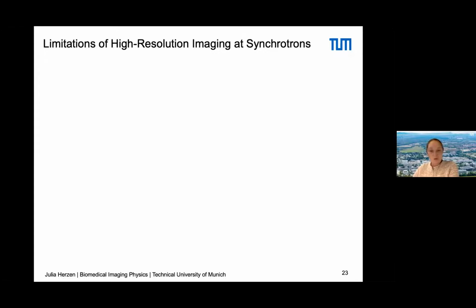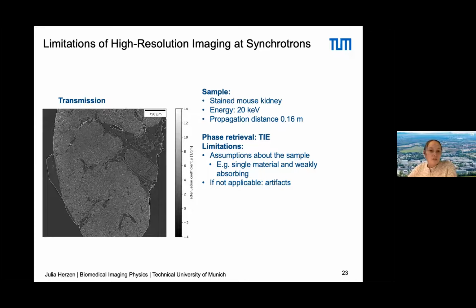The method that I presented to you, these gratings, was developed at the synchrotron. But if we go back to the synchrotron and try to perform high resolution imaging, we recognize that things change, because phase contrast is now accessible just by standard propagation. All the sources, if you go to Petra 3 or ESRF, are highly coherent and highly brilliant. So with any measurement, with any full field picture, you automatically have the phase effects.